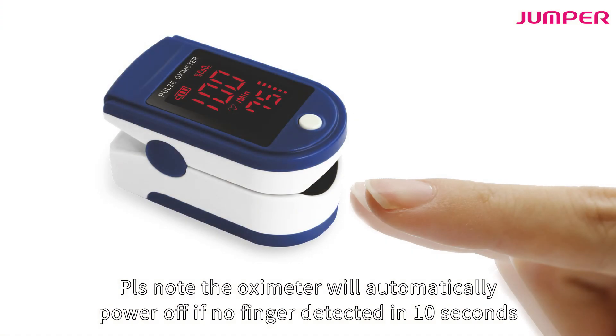Please note the oximeter will automatically power off if no finger is detected in 10 seconds.